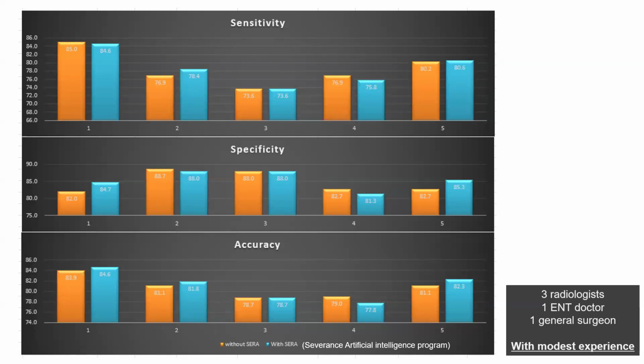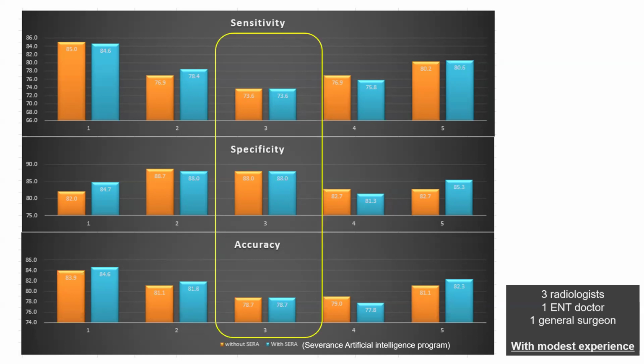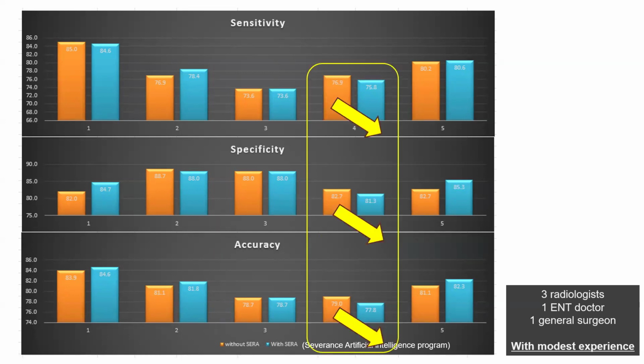This study investigated the diagnostic outcomes of 5 clinicians with modest experience with thyroid ultrasound when they got SERA support. 3 of them increased their diagnostic accuracy with SERA assistance. The AI assistance had no effect on one doctor's diagnostic performance. In addition, AI worsened one doctor's diagnostic outcomes.